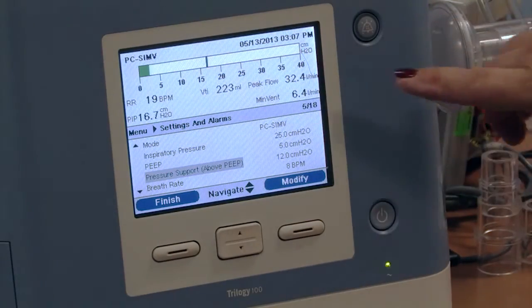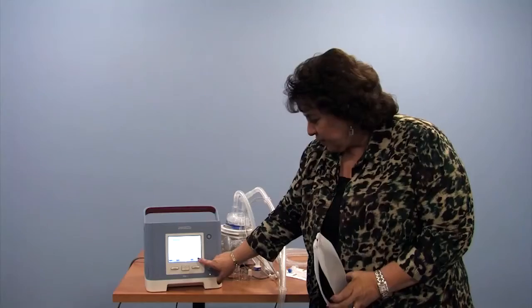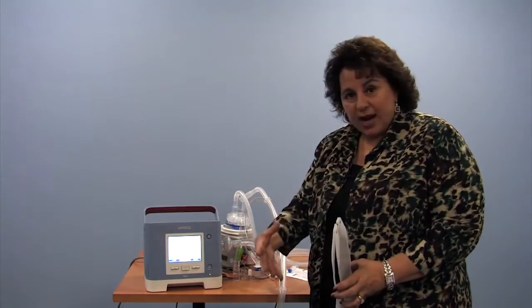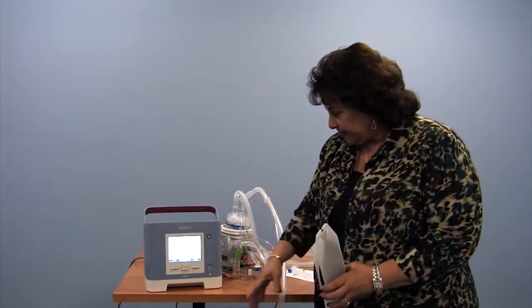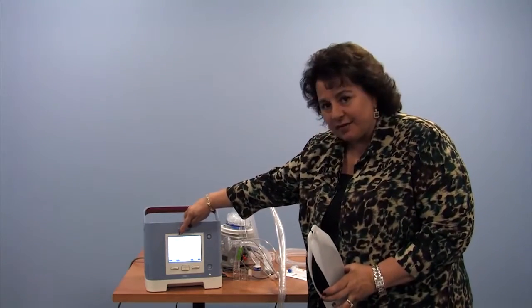What you might notice is that the machine is counting breaths per minute. So 8 breaths a minute is what the machine is going to deliver regardless. And your child can take as many spontaneous breaths with the pressure support in between those 8 as they desire. Those are the breaths that will go up to 17 and down to 5.